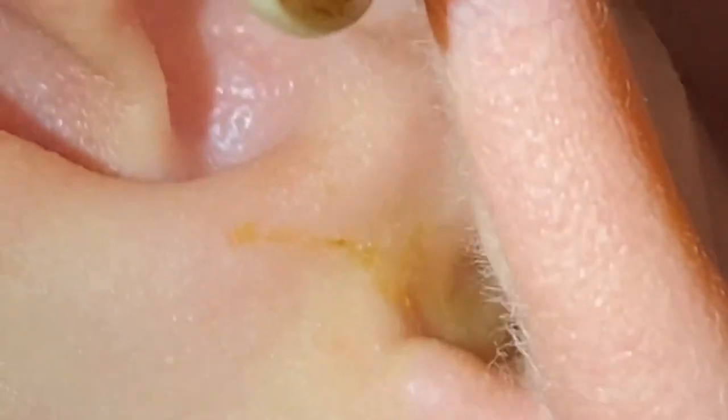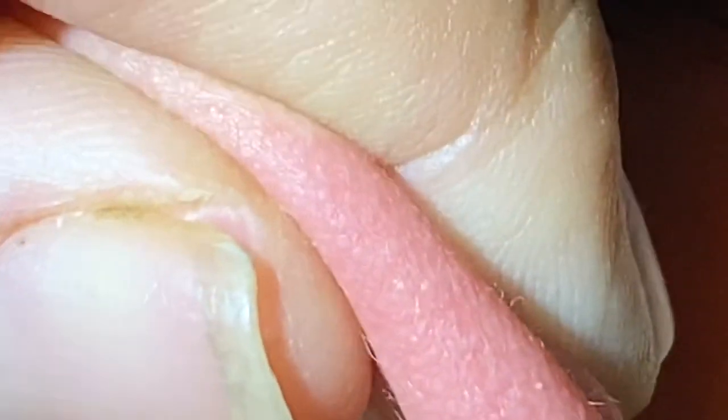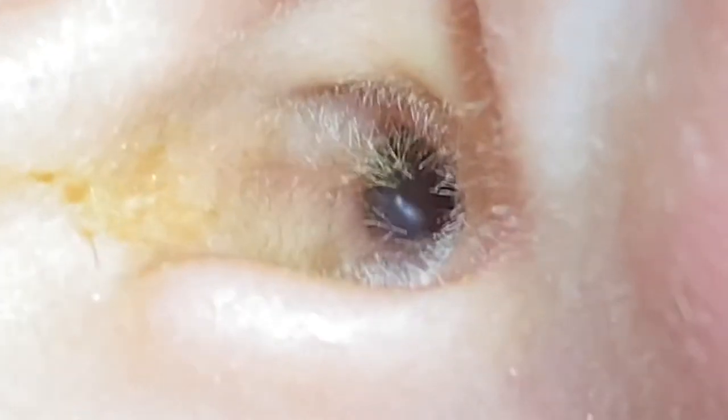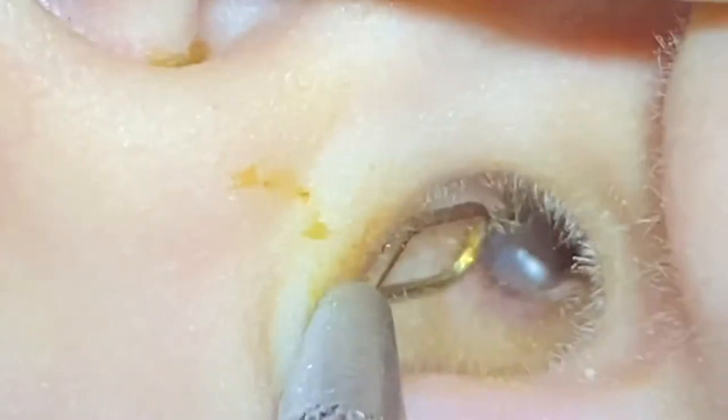Look at this — gross, gross, gross. Okay, I think this side is done. Look at this ear, let me see. Hairy ear — wait, let me see it here. Look at that, hairy ear! There's some in there but I just want to risk it. Yeah, that's a big hairy ear. It's actually not too bad.